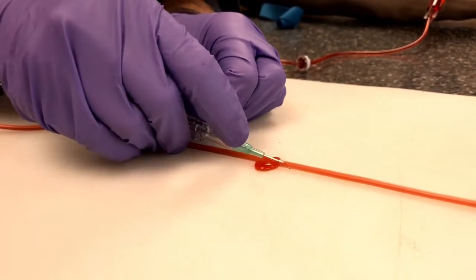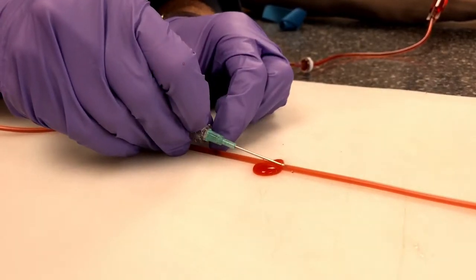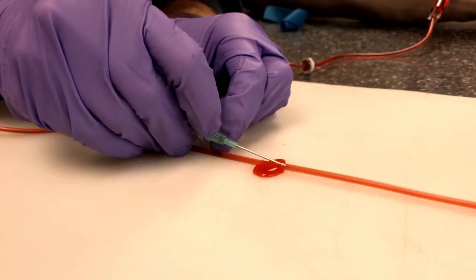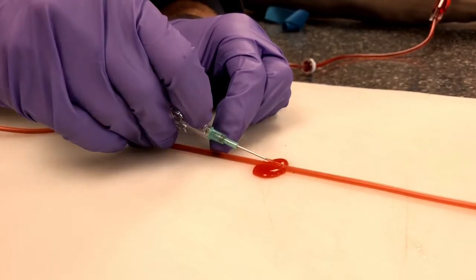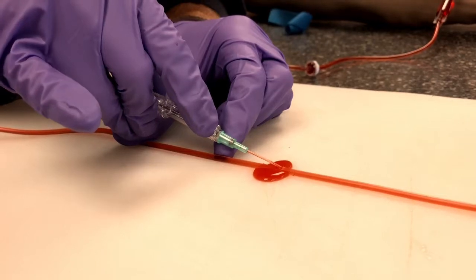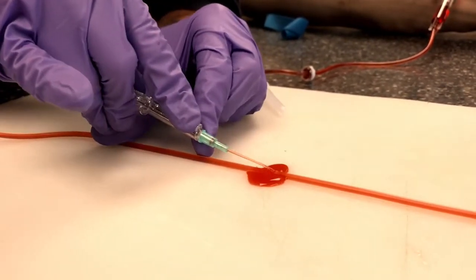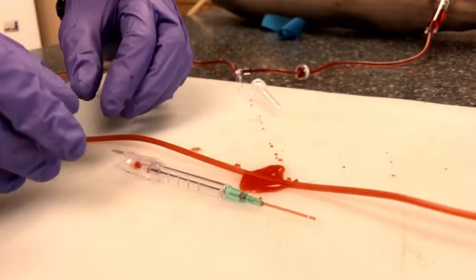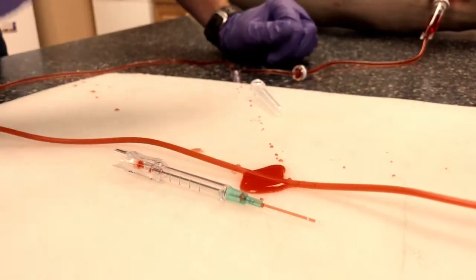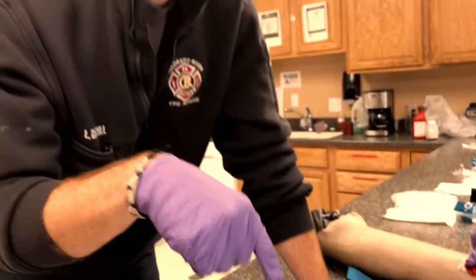What we don't want to do, and you can see what the problem would be, once you're here, if you started moving the needle backwards, the needle leaves, and you end up with all this catheter showing. And that's something that you don't want, because then you're either going to try to float it in, or you're just going to pop out and have this problem. Good. Those are your 4 common problems: angle, good traction, not getting the catheter all the way into the vein, and moving the needle backwards instead of the catheter forward.